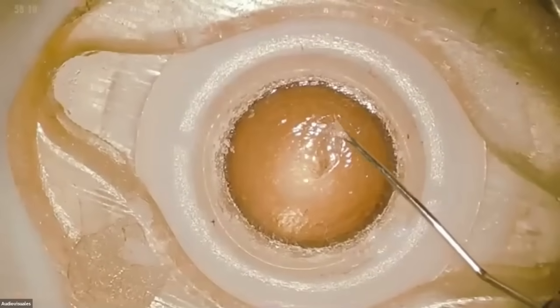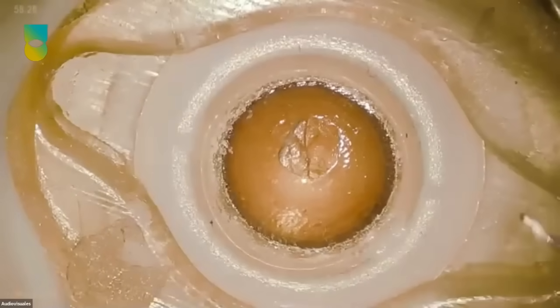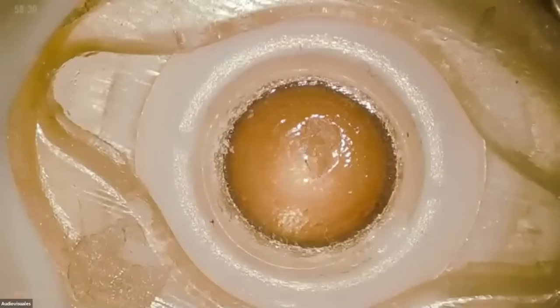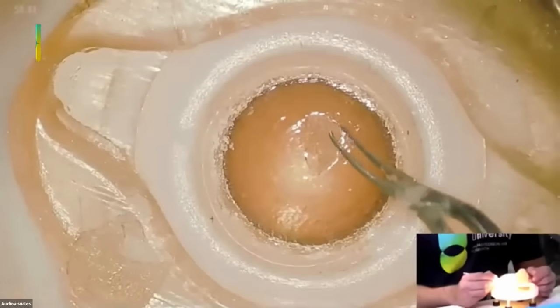You said right eyes are not the same as our left. Yes, when you have to operate your left eye and you're right-handed, if your forceps is long, you have the nose there. You don't have space because you have the nose of the patient there. So you have to look for appropriate forceps.